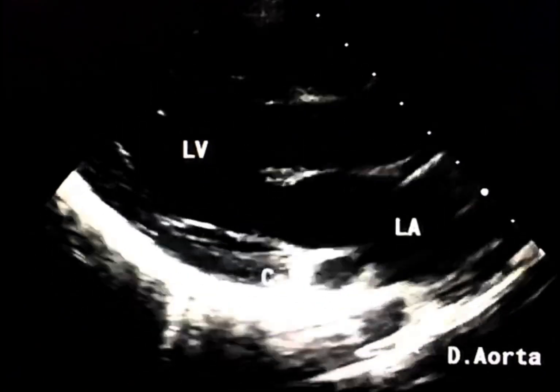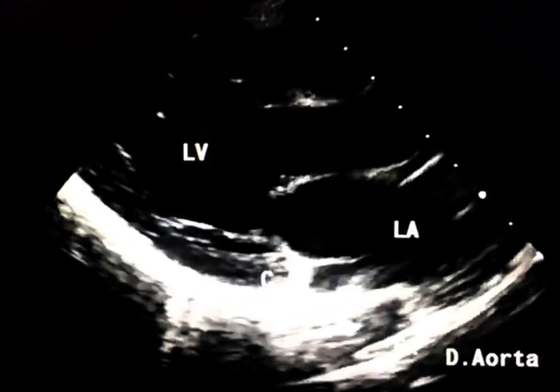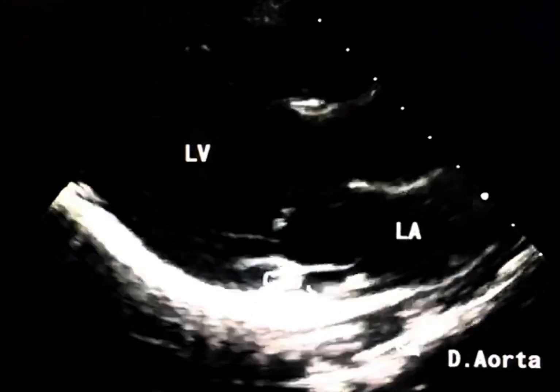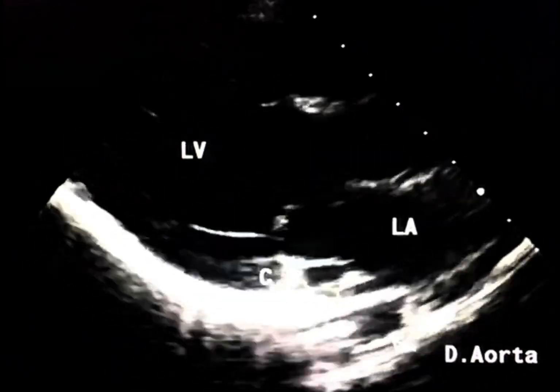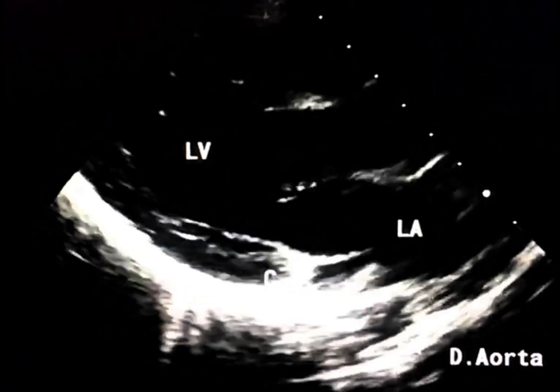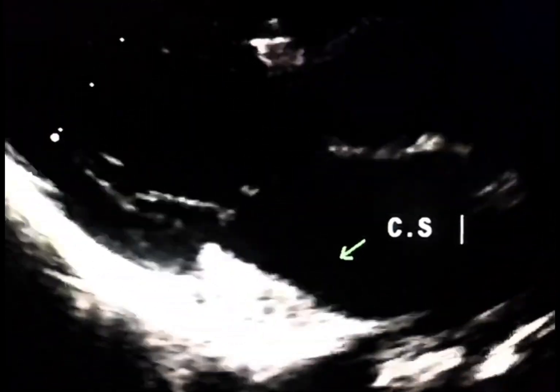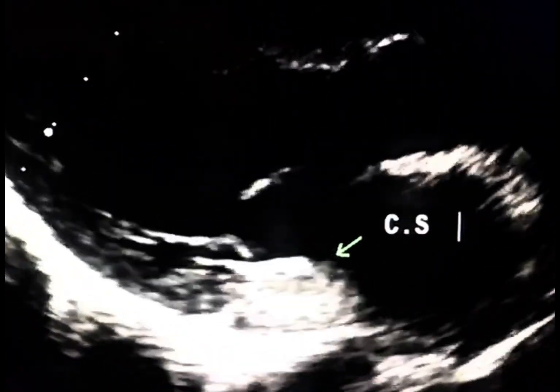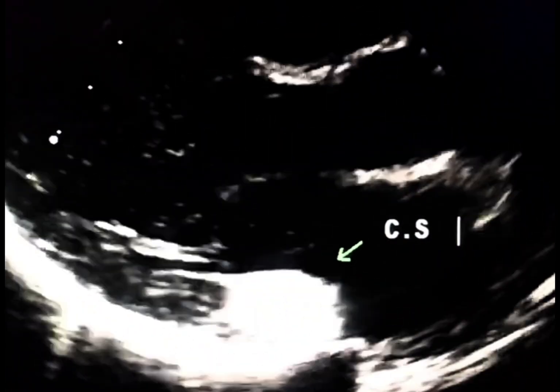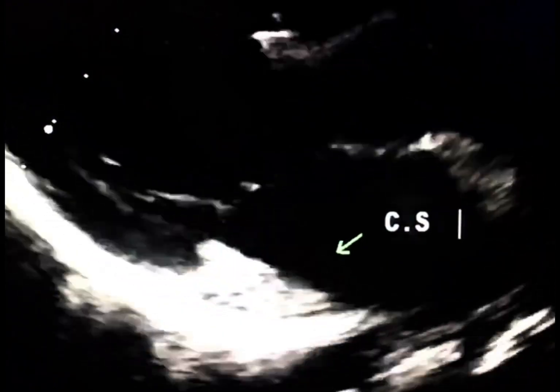This structure located inferior and posterior to the left atrium is a dilated coronary sinus, and its dilation is due to drainage from the persistent left SVC. In this contrast study, agitated saline is seen in the coronary sinus, causing it to appear opaque.